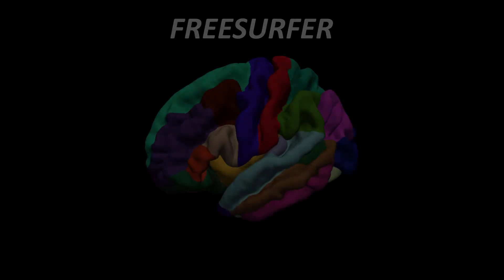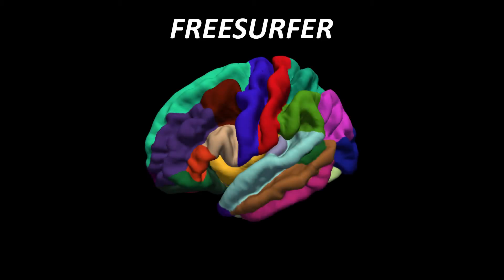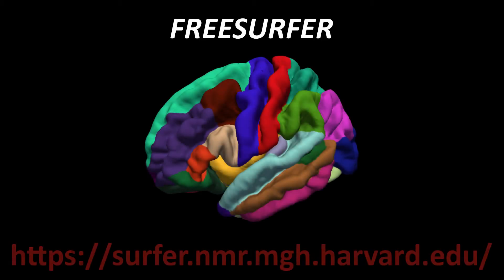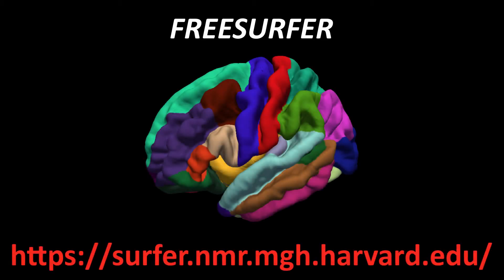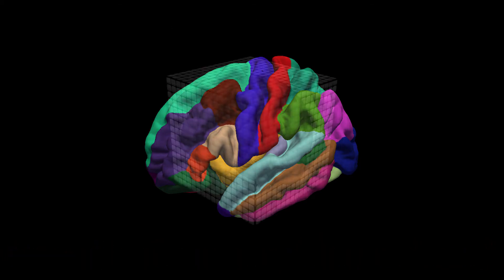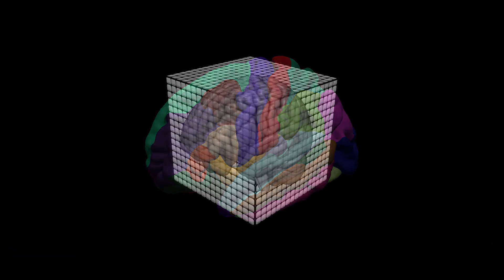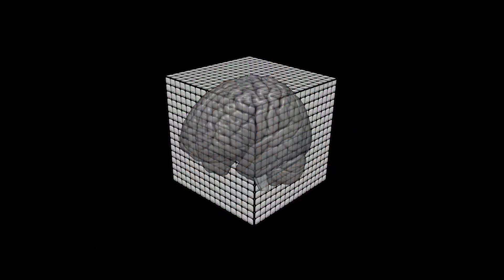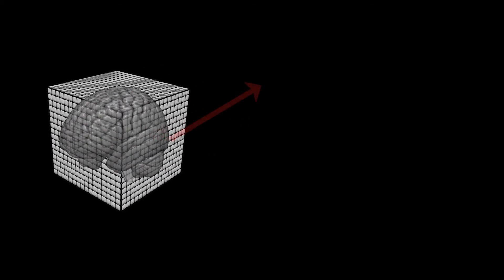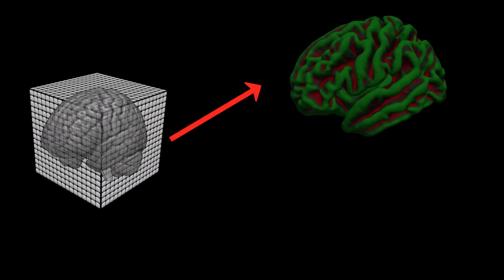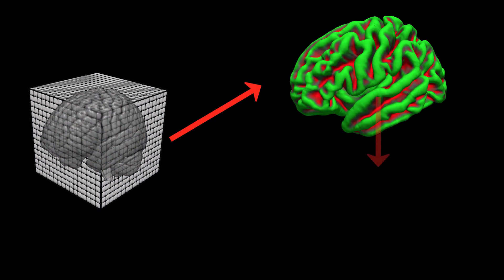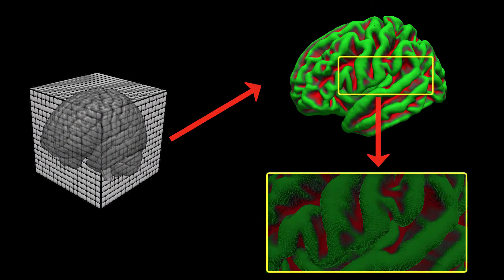To address these problems, we're going to use FreeSurfer, a program that reconstructs the cortical surface from a three-dimensional volume. The reconstruction process converts the volume from 3D voxels to 2D triangles.